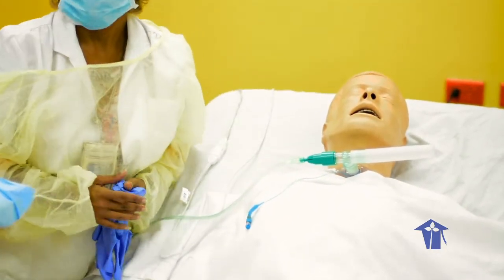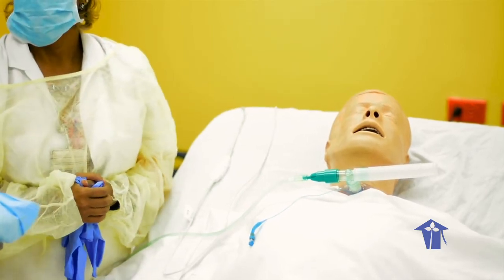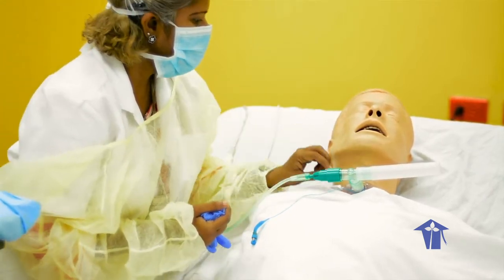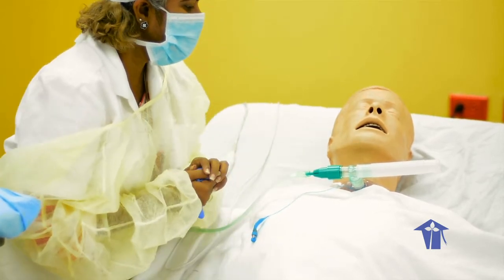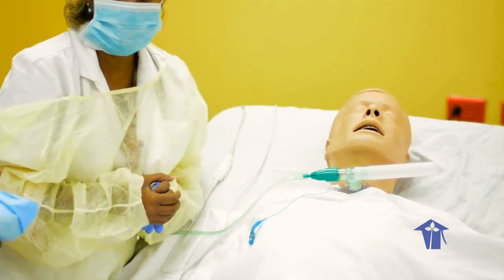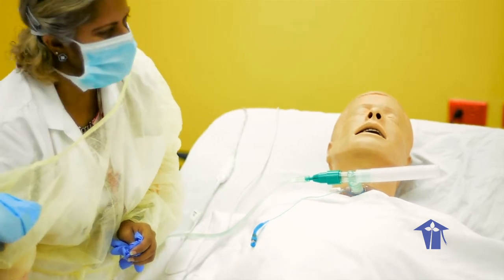Explain what you are going to do and the reason to the patient, even if the patient does not appear to be alert. All right, so Mr. Black, as I said, your tracheostomy needs some cleaning around the area in order to maintain sterility. We want to do that because we don't want you to get an infection in the tracheostomy. You understand what I'm saying? Okay, squeezing my hand, very good.